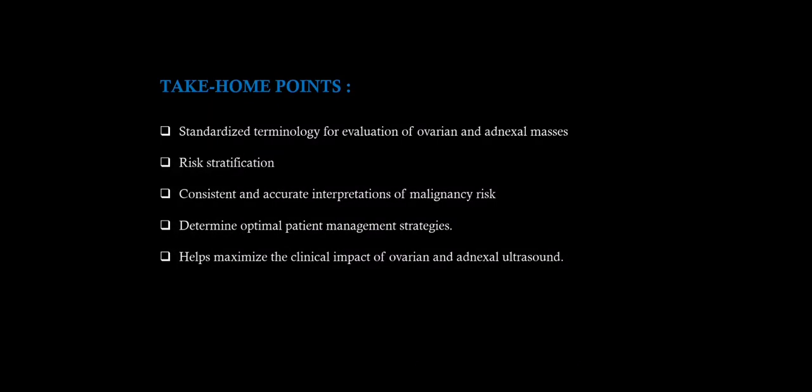So what we basically understand is O-RADS helps us in the standardized terminology that is to be used for evaluation of an ovarian and an adnexal mass. It helps us in risk stratification. It helps us provide a consistent and accurate interpretation of the malignancy risk, and this is uniform across all the radiologists. It determines optimal patient management strategies as per the protocols that they have suggested, and it helps maximize the clinical impact of ovarian and adnexal ultrasound.